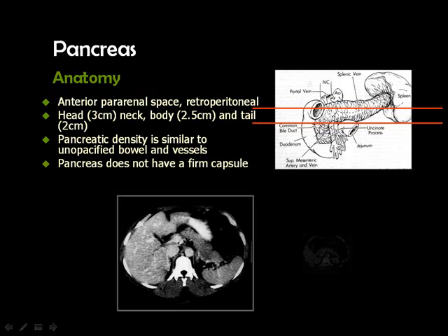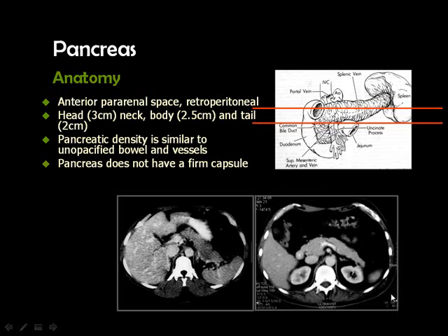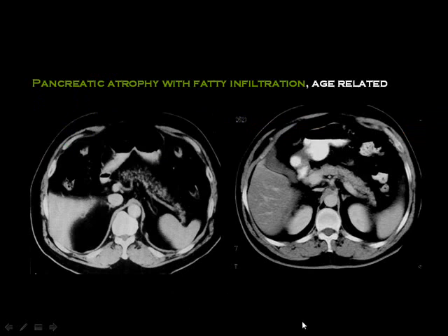hit the pancreatic head. But in some people, you can see this appearance of the pancreas. You can see the whole pancreas in the same section, the pancreatic tail, body, and the head, because in this particular case, the pancreas lies horizontally in the abdomen. If you look at the abdomen and you see this pancreas, posterior to it, there is a vein, which is the splenic vein.